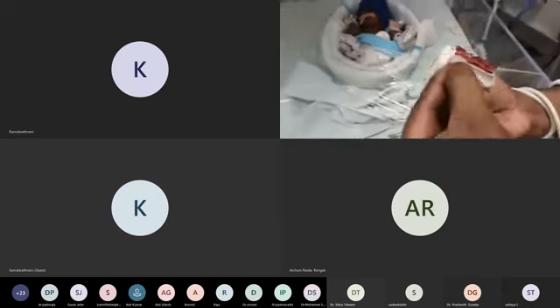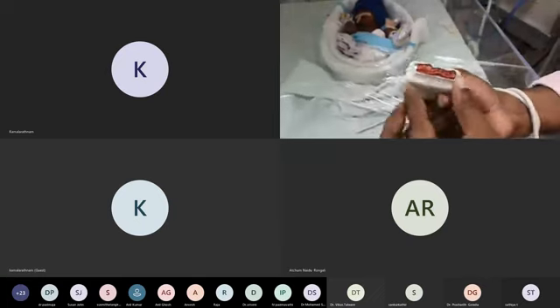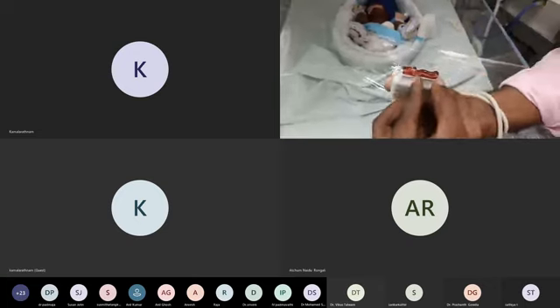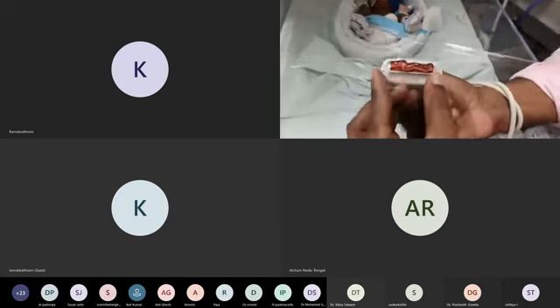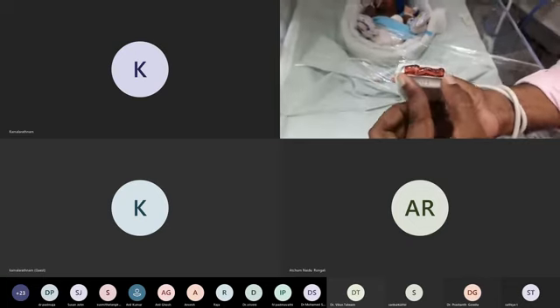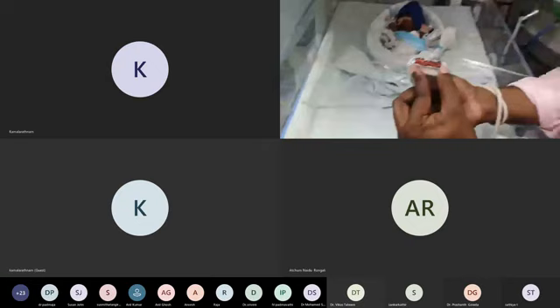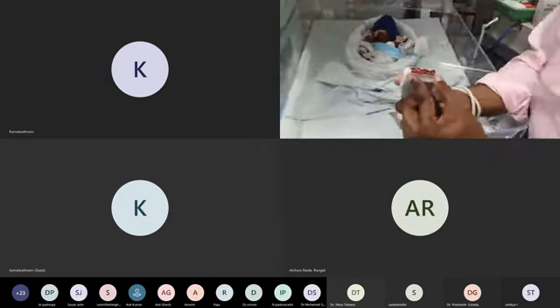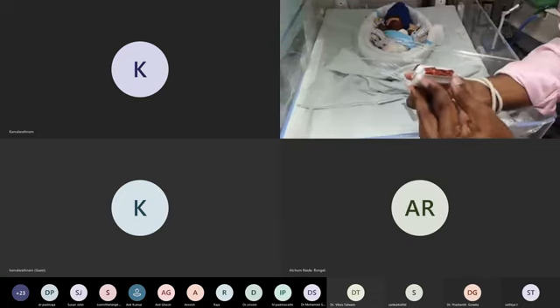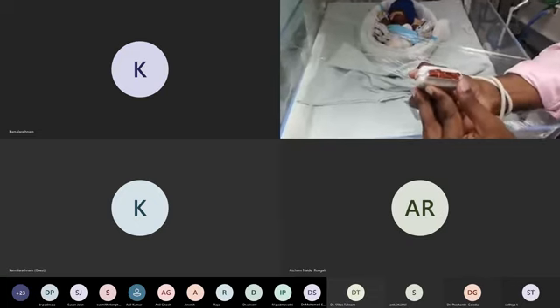Okay, but this one is very big for a preterm baby. But I am using this one because I don't have so much money to buy a smaller probe. So I am using this for neonatal hip as well as central lines as well as septic arthritis as well as for this purpose. Suppose if you are rich, like our Dr. Prashant Gowda, you can go ahead and buy a hockey stick probe, a 3 lakh rupees probe.